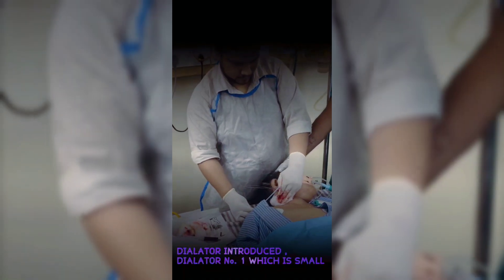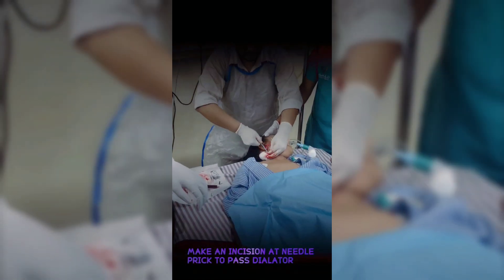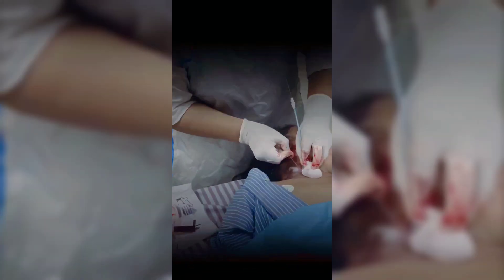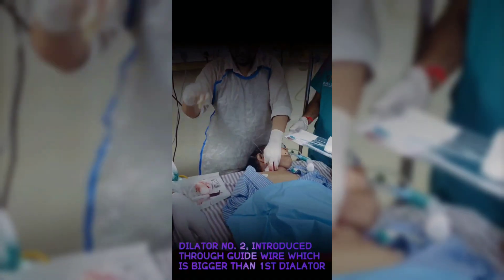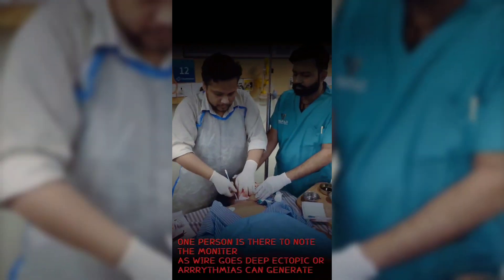Dilator number one — the smaller one — is introduced over the guidewire. Make an incision at the needle prick site to allow the dilator to pass. Dilator number two, which is larger than the first, is then introduced over the guidewire. One person is assigned to monitor the patient on the monitor.